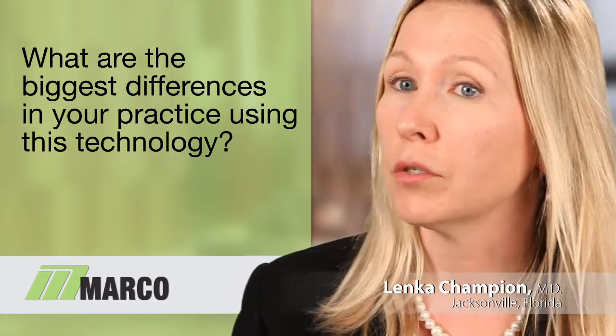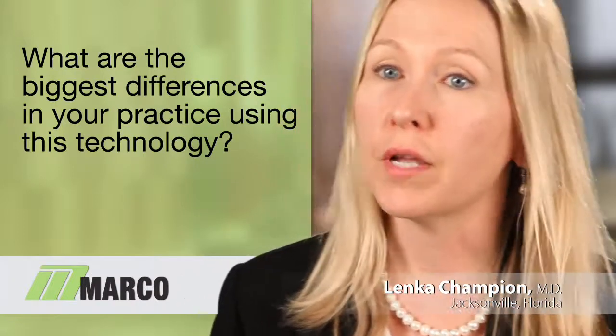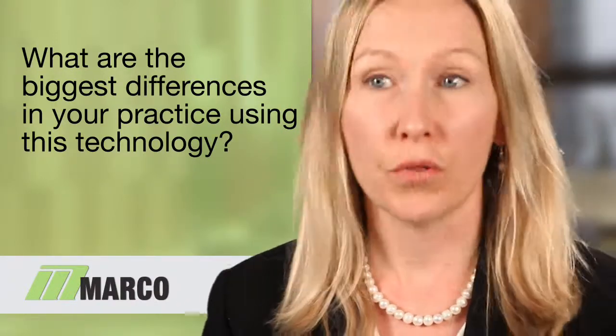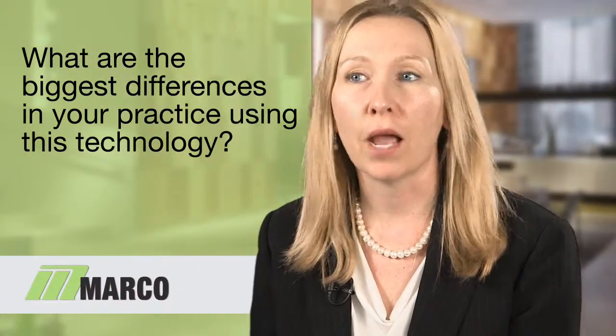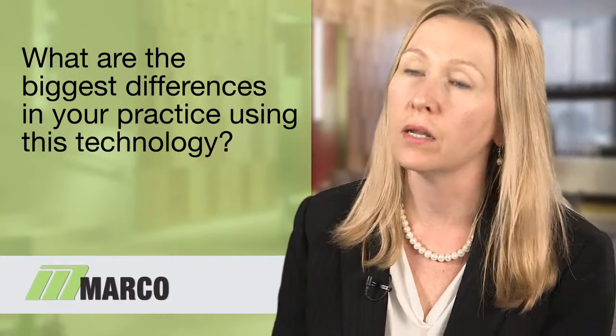Well, prior to OPD, in our toric patients, on postoperative day 7, we used to dilate these patients and check their alignment of the toric IOL with the dilation. Sometimes that was difficult because these patients sometimes don't dilate very well, and then they had to sit there for 45 minutes to get their pupils dilated.